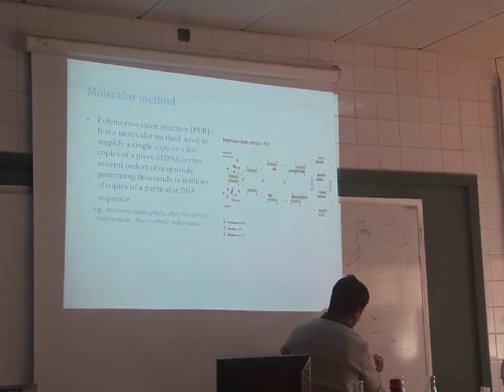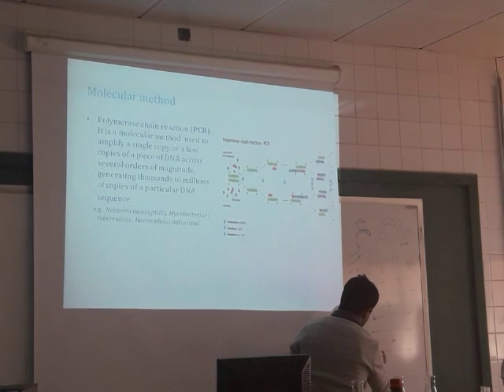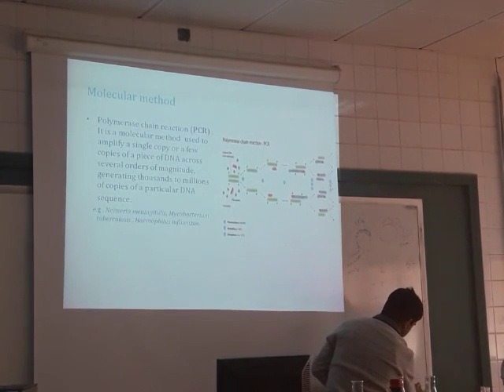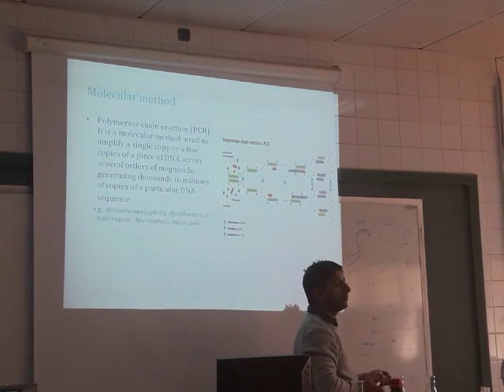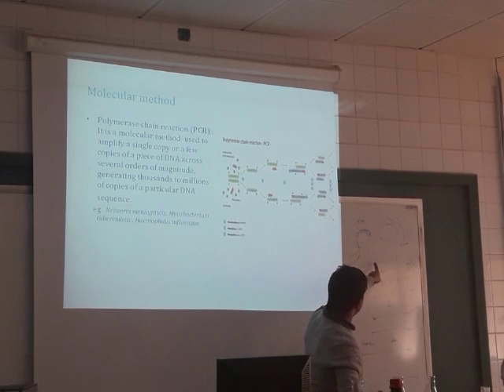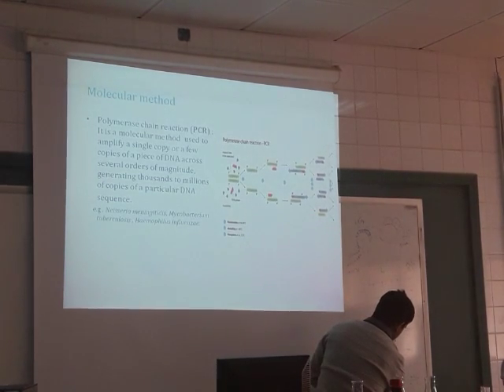This is an enzyme, called DNA polymerase. And here also an enzyme. This is the purpose of PCR. You see 2 bands, but now here you will have these 2 bands plus these 2 bands.